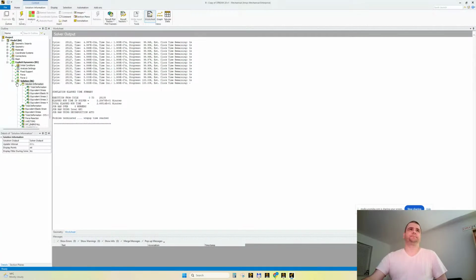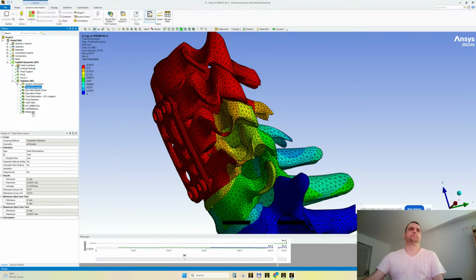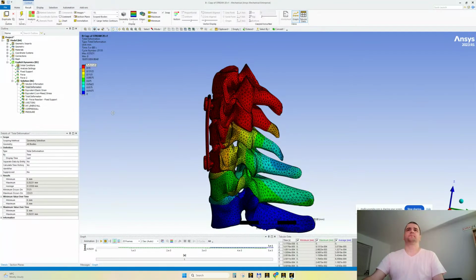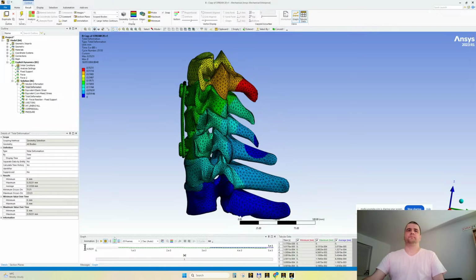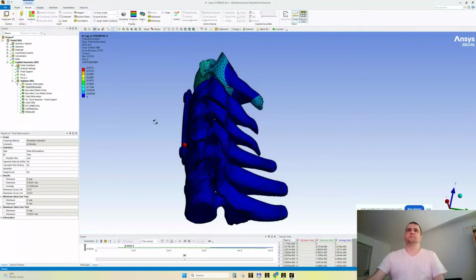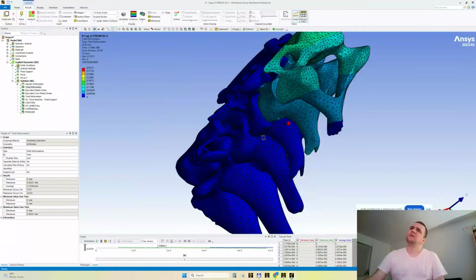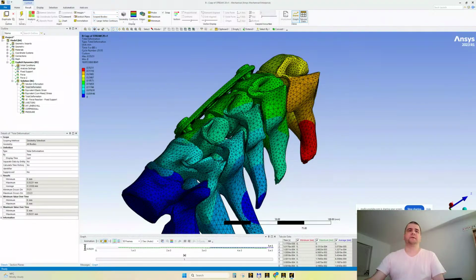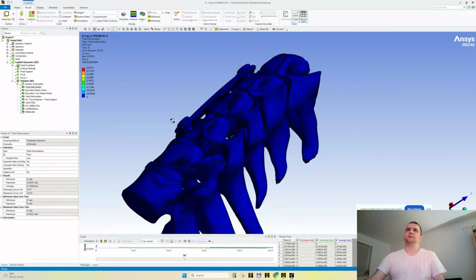Let's see the results. There is a scaling here, 15. I can show it to you through scale, and it's not so evident what happens. Let's move it to 5. 5 will be better. Not exaggerated, not inexistent.